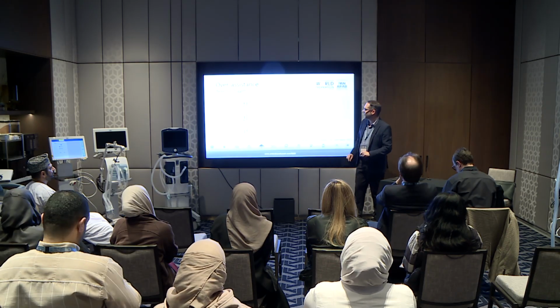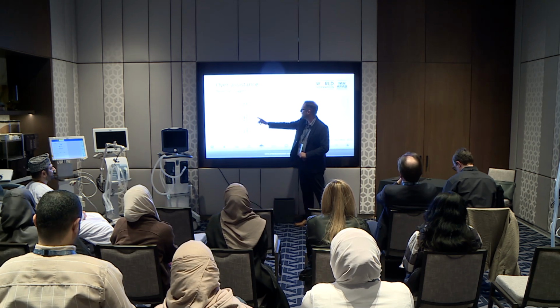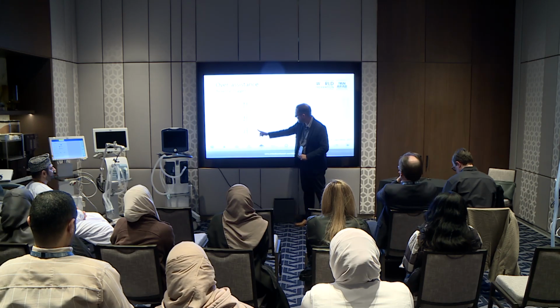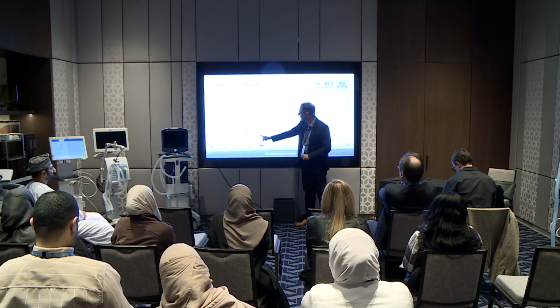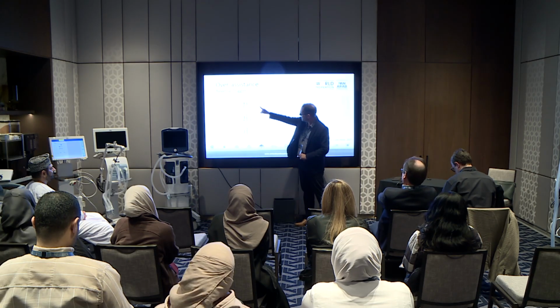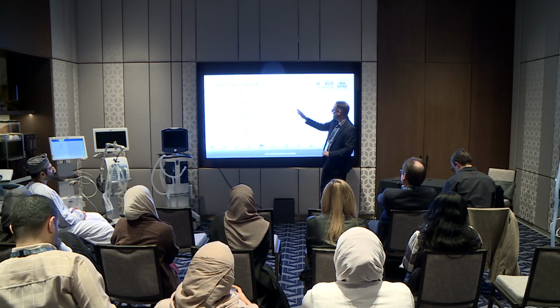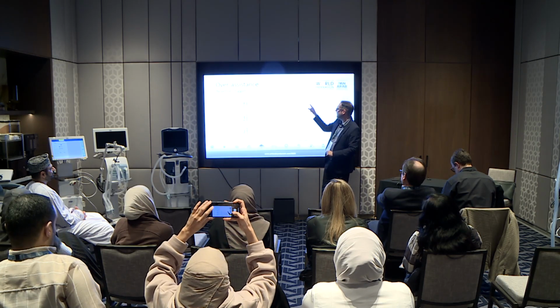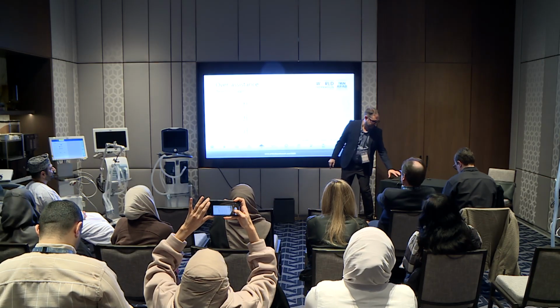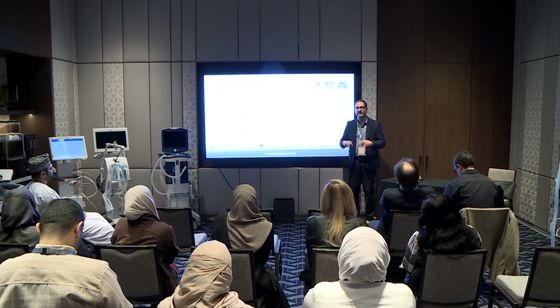It can happen in volume control as well. The ventilator is pressurized, there's no trigger here, the ventilator goes up here, the peak is there, and then the effort is starting where the gray line is. This is esophageal pressure. This is where the effort starts, and so it's after insufflation, the machine is triggering the patient, they're making an effort, and you can still see this flow after the ventilator cycles off. You can see this ongoing flow, this upward deflection. Post-inspiratory loading. Okay. We sometimes used to refer to that as eccentric contraction.